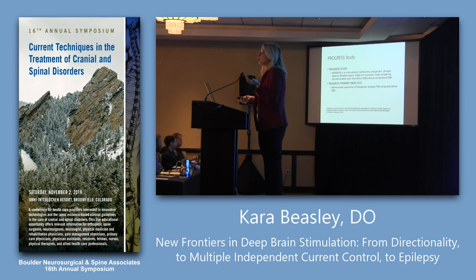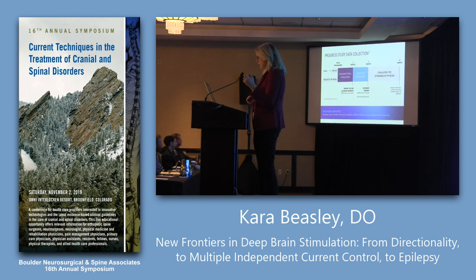And essentially it was looking at, is directionality superior or is directionality at least equivalent to the ring mode that we have traditionally had? And TW is the therapeutic window. So they wanted to show that you actually got a better therapeutic window using directionality than with omnidirectional. So they enrolled, they implanted, and everybody for the first 3 months after the initial programming got omnidirectional stimulation, and they looked at the therapeutic window, and then everybody got directional stimulation, and they looked at the therapeutic window, and then afterwards they let the physician decide which they liked better, what they wanted. Up to 12 months, this was a 12-month study.